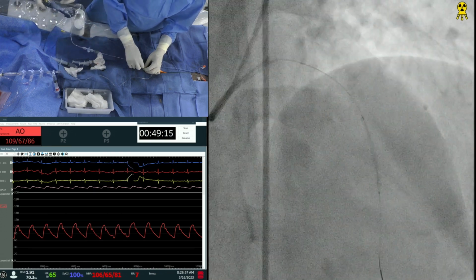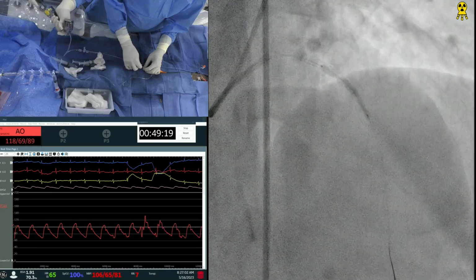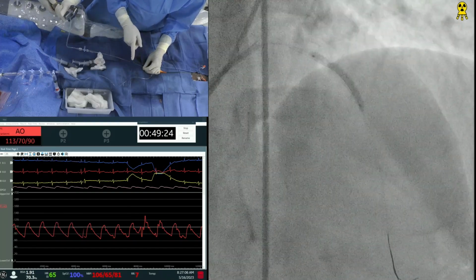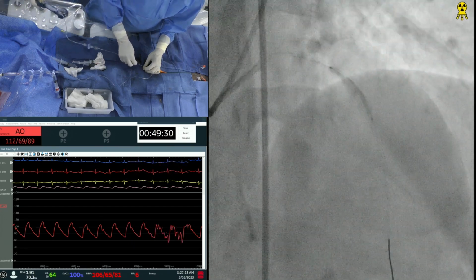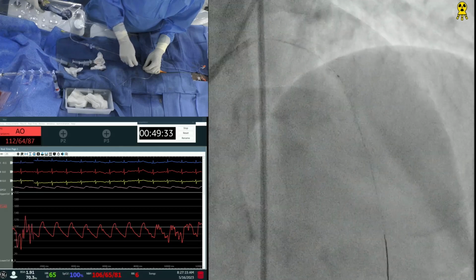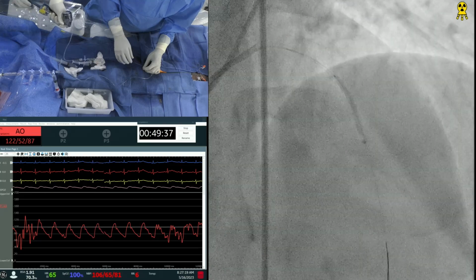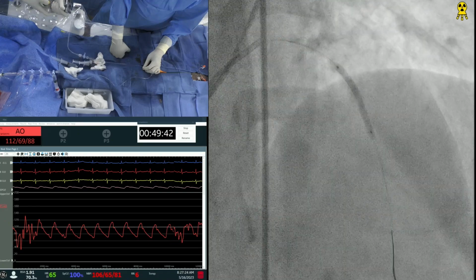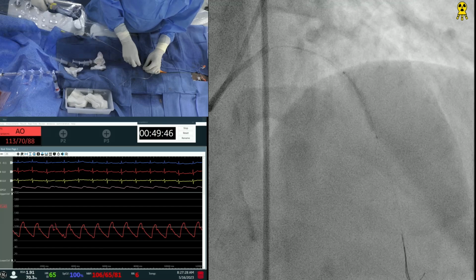We always try to, because once we have a publication, we've put them into the same category; otherwise we have to exclude those cases. So we try to use the same stent as much as possible. Now, if the patient comes back even in 1 month and you start seeing some thrombus or restenosis, then we'll definitely change it. But if not, we'll keep it the same. Let's say this patient comes back with circumflex stenosis in 2 years and the 2 stents remain good, we'll still use the Promus even at that time.